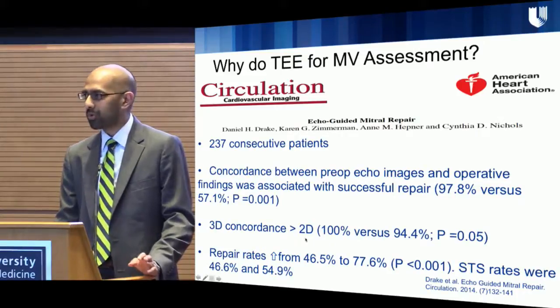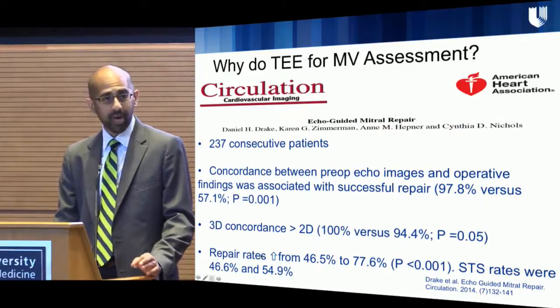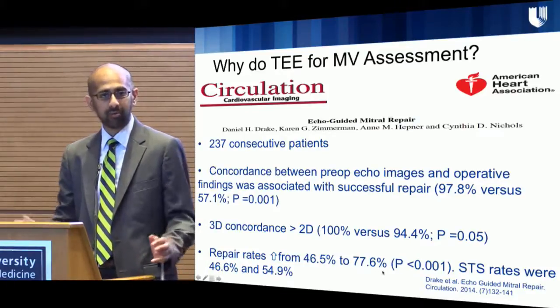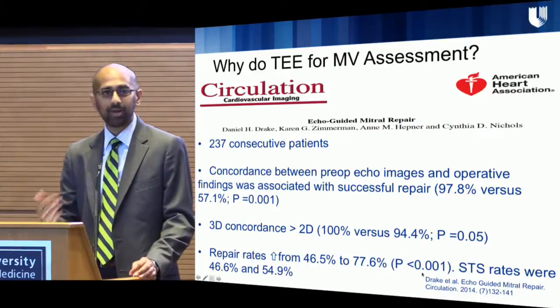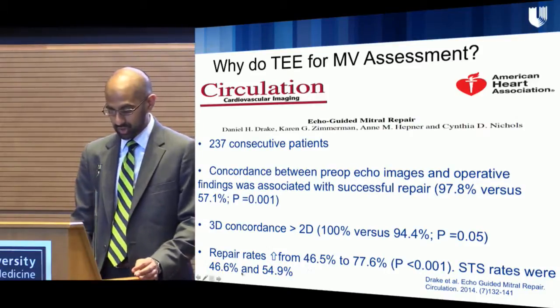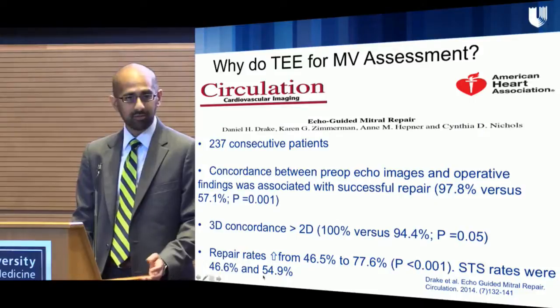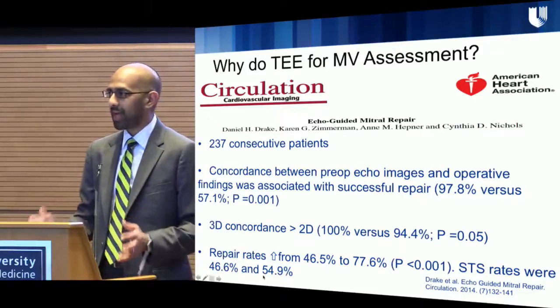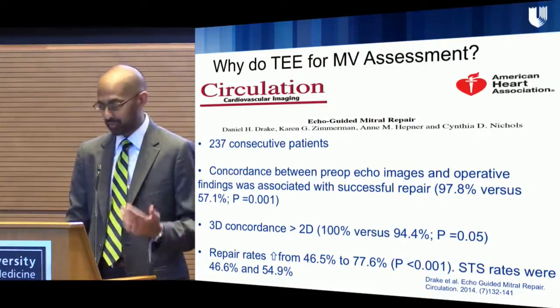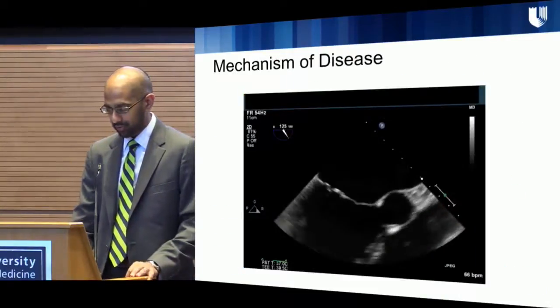And perhaps most importantly for everyone in the room, the successful repair rates on the mitral valve increased from 46.5% to almost 78% over the time frame that they had this protocol. And they compared that to the national average in the STS database, which didn't really change much at all, 46.6% to 55%. So here's some real outcome data that instituting a protocol and going to 3D echo may actually help to improve your mitral valve repair rates.